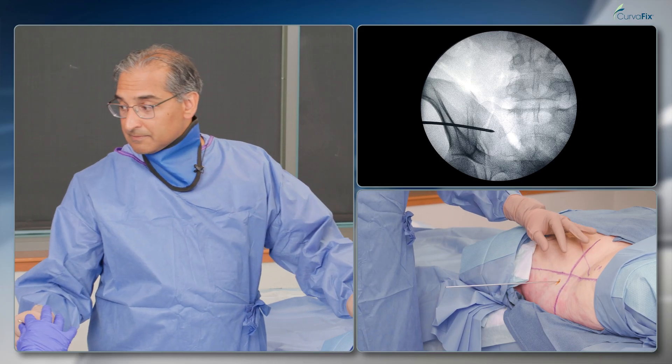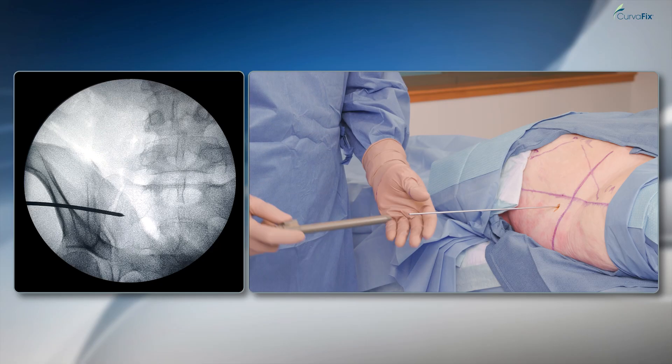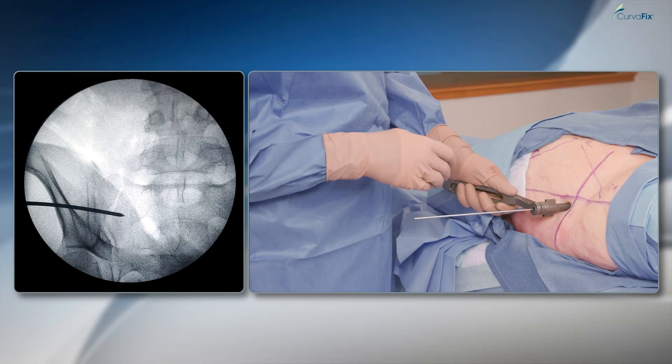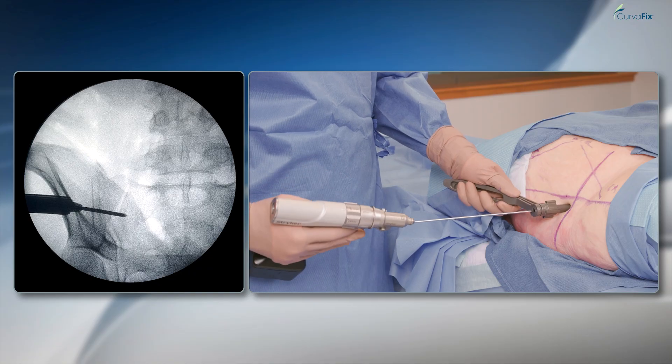I'll take the triple sleeve. The triple sleeve, particularly the Trocar, allows me to get through the soft tissue. I'll take the wire driver and redirect this wire a little bit.